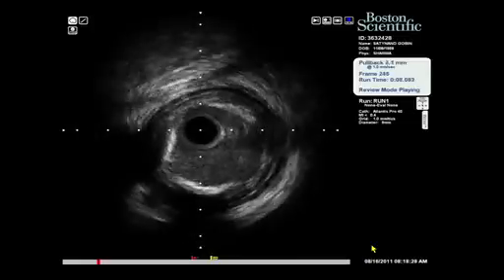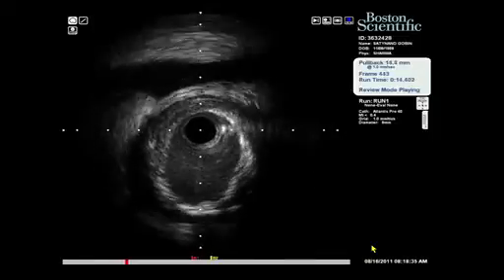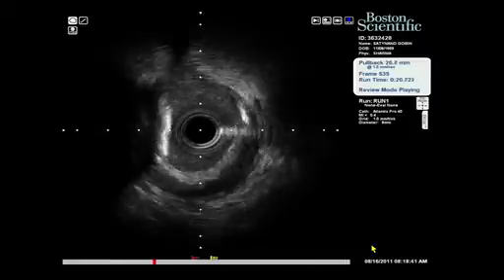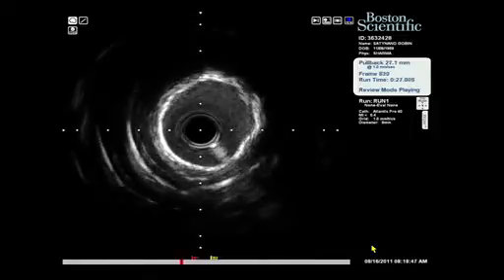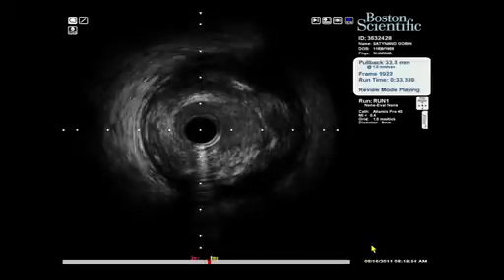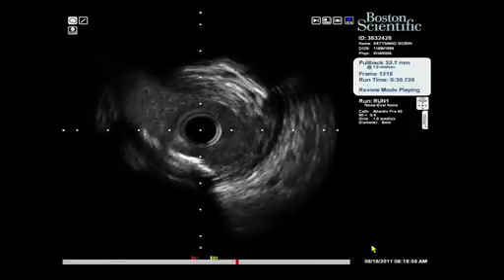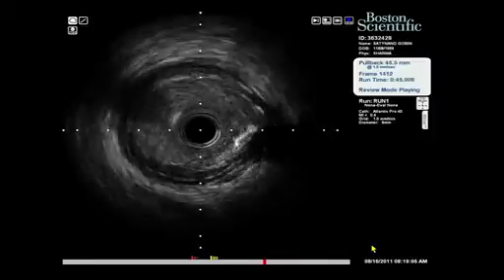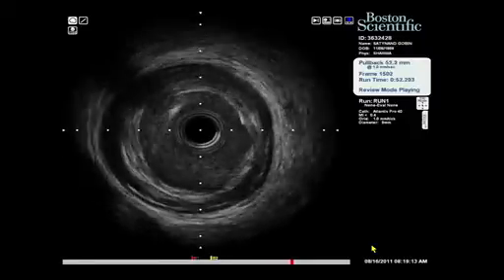Yeah. So just with the initial angiogram, the question always comes in this kind of situation of how we are going to handle this case, that there is mild to moderate calcium in the mid RCA level. The more important thing is, do we just take care of that mid RCA disease and leave all the distal disease for medical therapy, versus we take care of one of the branches at the level of the bifurcation, more importantly maybe the PDA versus the RPL. For that, it is very important to know exactly how that distal RCA stenting technique was done. Just by wiring we could go into both the branches, but that does not mean getting a device into this particular area could be easy.